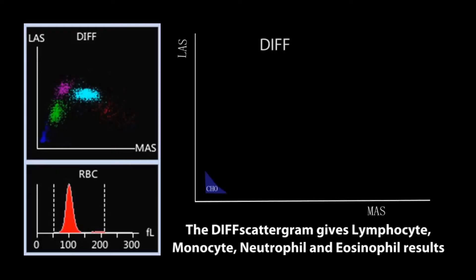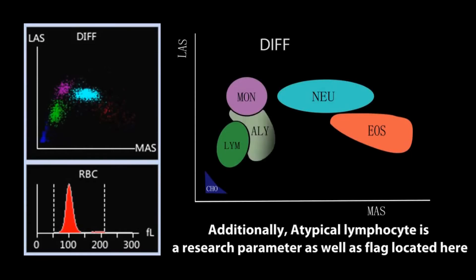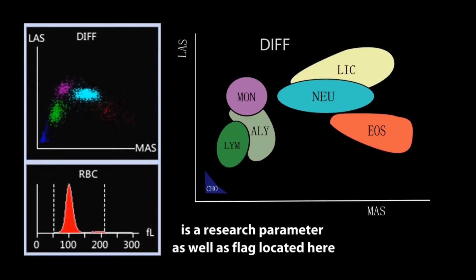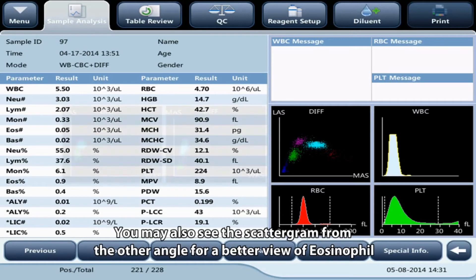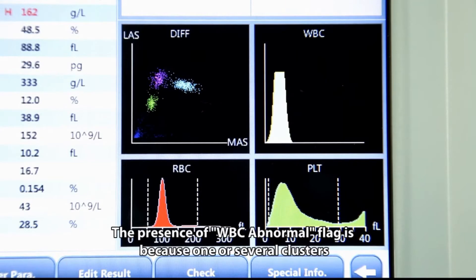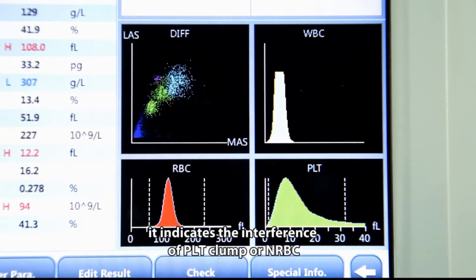The DIFF scattergram provides lymphocyte, monocyte, neutrophil, and eosinophil results. Atypical lymphocyte is a research parameter as well as a flag. Large immature cells — including promyelocyte, myelocyte, and metamyelocyte — are also a research parameter and flag. NRBC is a flag as well. You may view the scattergram from another angle for a better view of eosinophils. The presence of a WBC abnormal flag indicates one or several WBC clusters are not well differentiated, or indicates interference from PLT clump or NRBC.